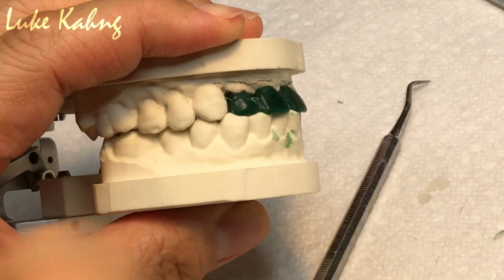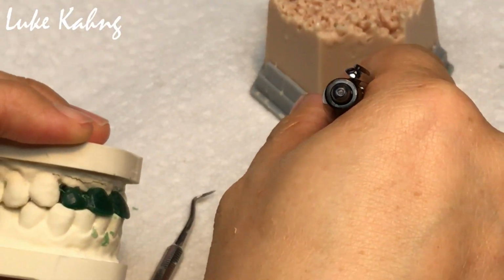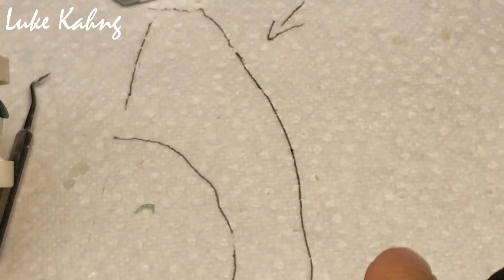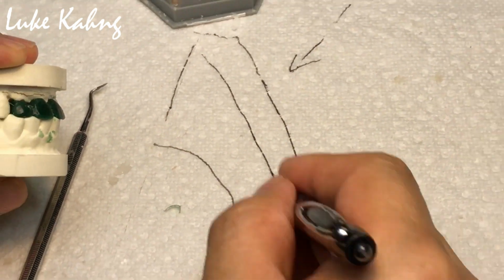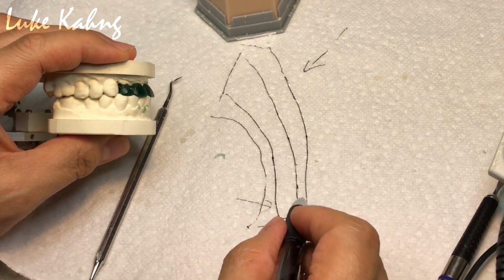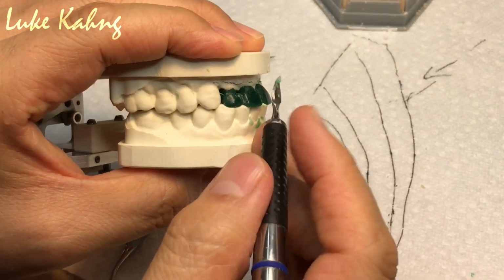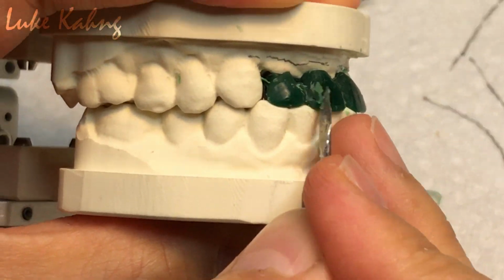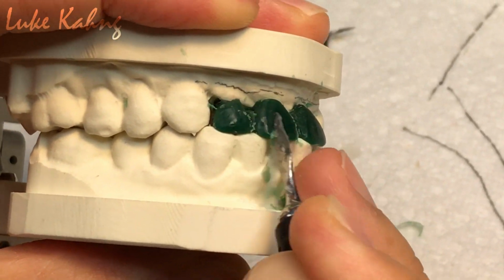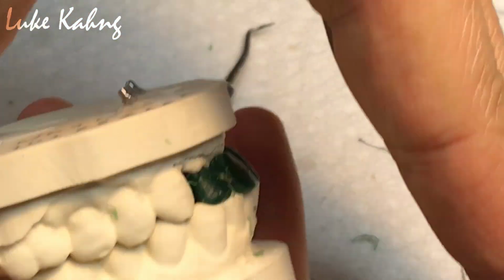So whenever I finish these cases, here is the final, right? So this is what I'm talking about, facial contour. I'm trying to cut it here and then make the metal. Here you cannot do much about it, but here I can cut it. So here, like this. Yeah, that's what I need. So technically this, not that, right?